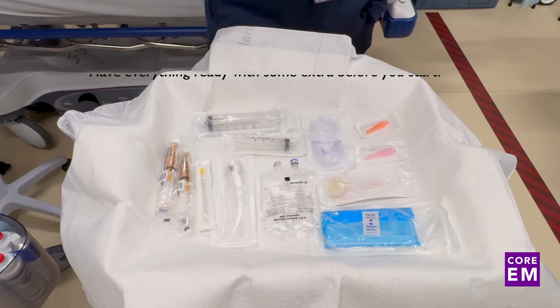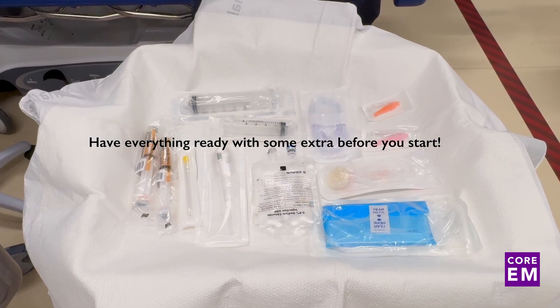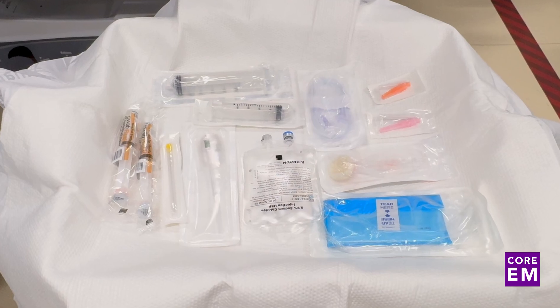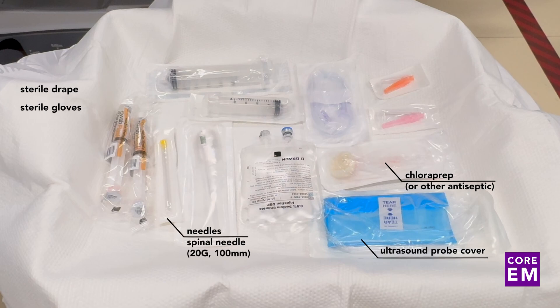Here we have some of the different materials you'll need for this nerve block. First, you'll need your different sterile materials. This is a procedure that should be done with standard sterile precautions. You should have sterile drape and chloroprep to cleanse the area, as well as a sterile ultrasound probe cover and sterile gloves. Beyond that, you'll need your needles for accessing the space — either a spinal needle, a 20G 100mm spinal needle that most emergency departments have, or some emergency departments have specific echogenic needles for nerve blocks.